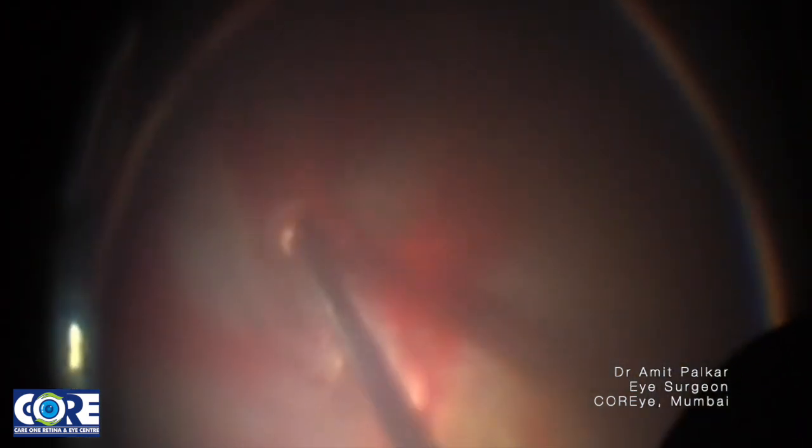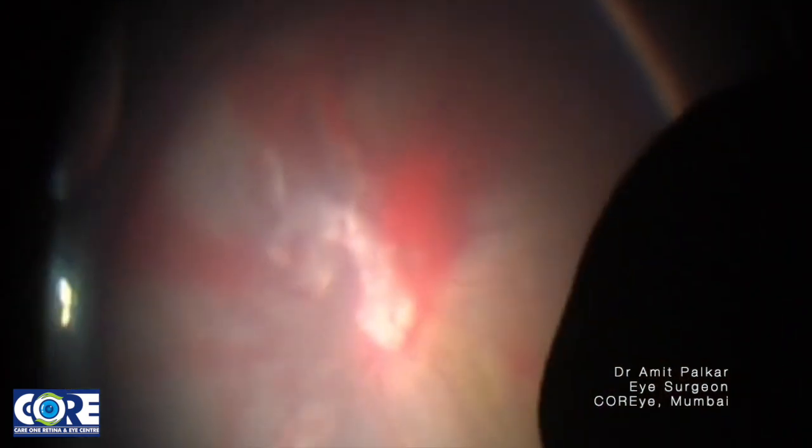So clearing up the heme again, a good view is imperative in such cases. This patient has undergone the cataract surgery followed by vitrectomy.